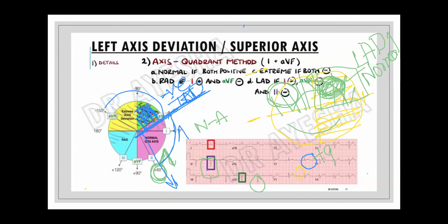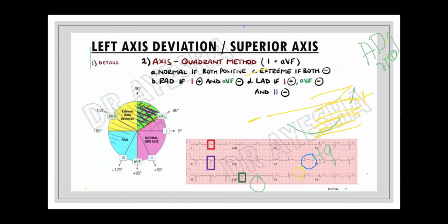Why are you using lead 2? Clear or not? No? Is it clear for sure? Okay, that's great.